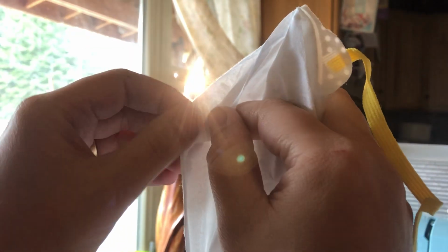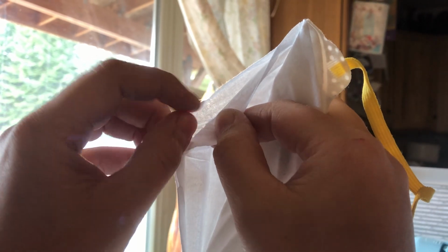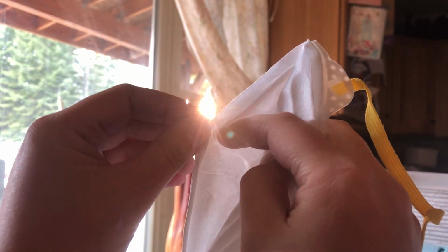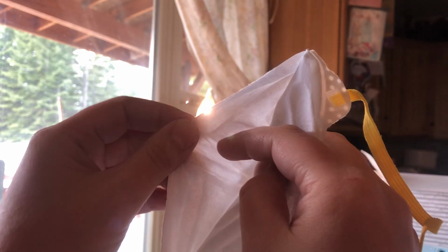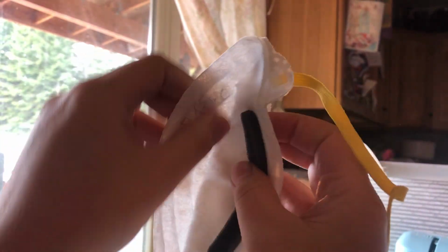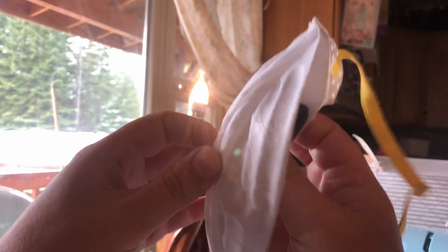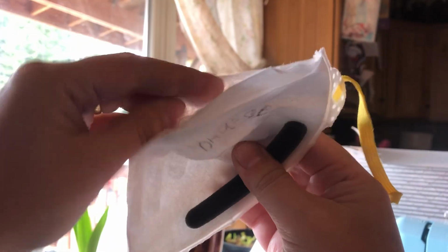There, I kind of got them apart. So we got two layers of this, and it's a pressed fabric also. So we got two layers of that soft stuff, and then on the inside one more layer of stiff interfacing. It's just like the stuff that was that second layer here.